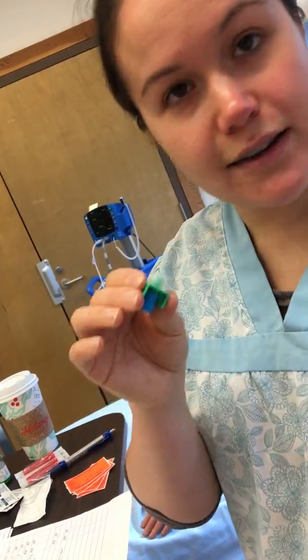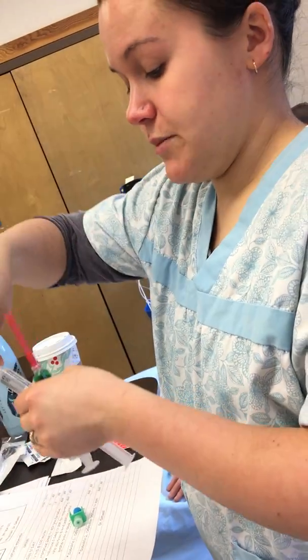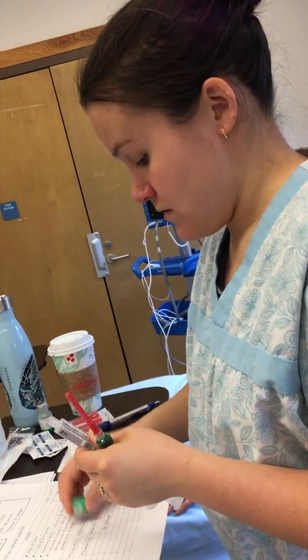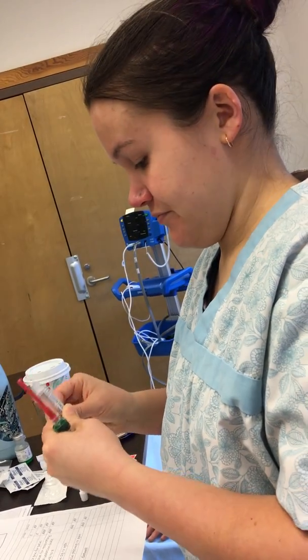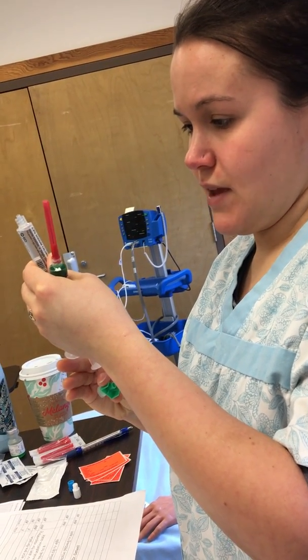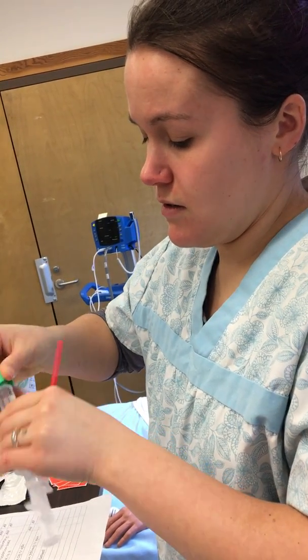I call it a little Lego piece because I forget what it's actually called. I'm going to get a saline, get the air out of it, and blue to new. So I'm attaching this, I'll get the air out with a no-touch technique to keep it sterile again.